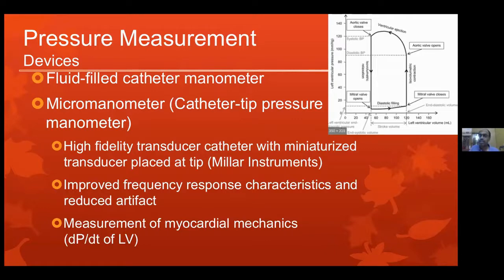And so after that, there will be much more clarity. The question is how frequently a transducer should be changed. Retain the transducers as long as they are showing the representative pressure trace. Now, again the question will be how you will identify what is the normal shape and pattern of each and every wave. We are going to come to it about 10 slides later.